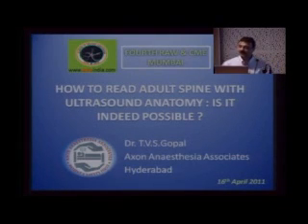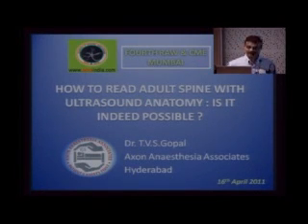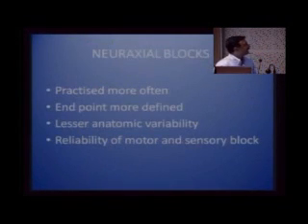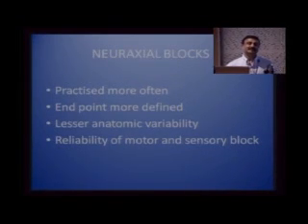I've been asked to speak on how to read the adult spine with ultrasound anatomy. Is it indeed possible? As with anything else, to begin with, it is difficult, but if you practice and persevere, it is indeed possible. Neuraxial blocks are something we all grow up with right from our first few days in the anesthesia program, and we are very, very comfortable doing. We are quite happy to do a spinal or an epidural or put in an epidural catheter. So we practice neuraxial blocks very often.